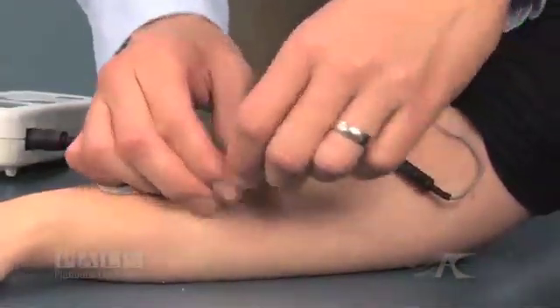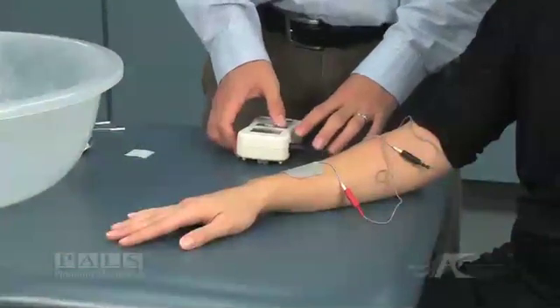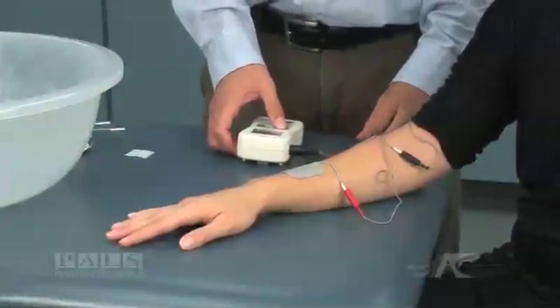Once the system is set, turn the stimulator on and slowly advance the amplitude according to your patient's tolerance.